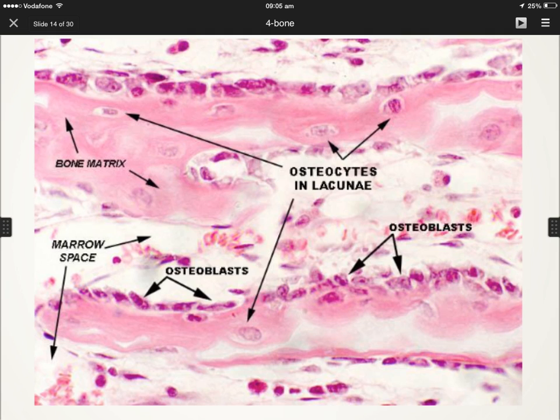You may be asked about the site of the spongy bone. Of course, you all know that the small or irregular bones or the epiphyses of the long bones are all made of spongy bone. In this picture, you should diagnose the following. You should diagnose these cells on the surface of these bony trabeculae. These cells on the surface, they are free cells, so these are the osteoblasts.